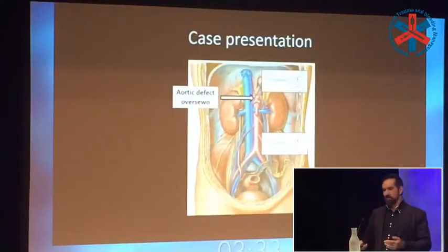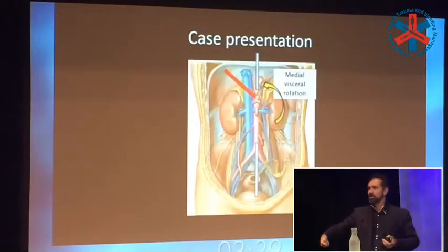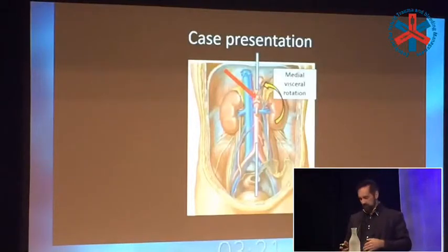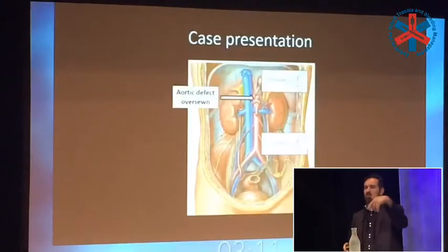During the course of that dissection, my assistant, who was supposed to be holding onto the REBOA catheter, wasn't doing her job properly, and the balloon was being pushed down in the aorta. And soon enough, I had major bleeding again in the operating field. However, by then I had seen what I wanted to see, and it was very easy for me to put a finger on it, put a clamp above and below, and to deal with the injury.